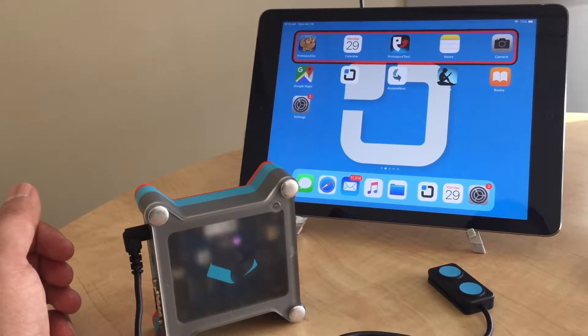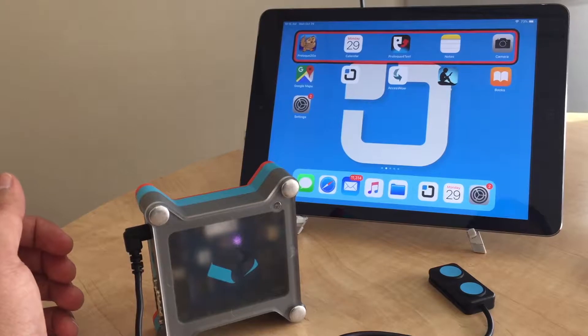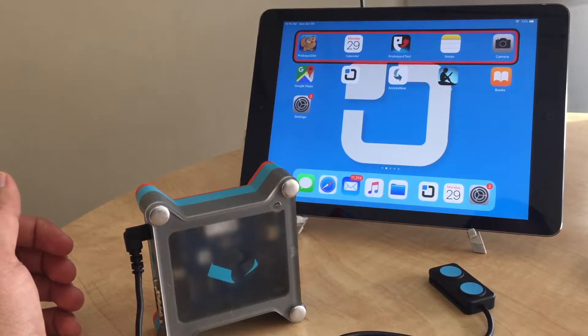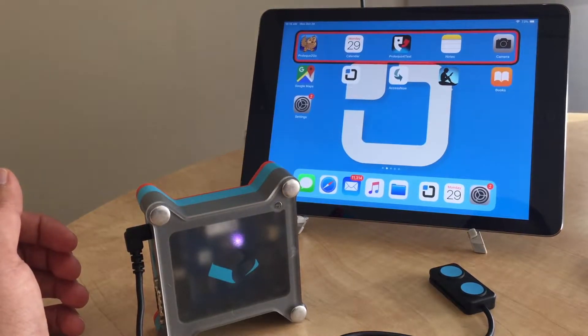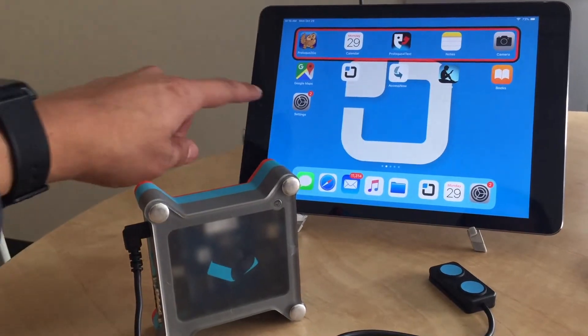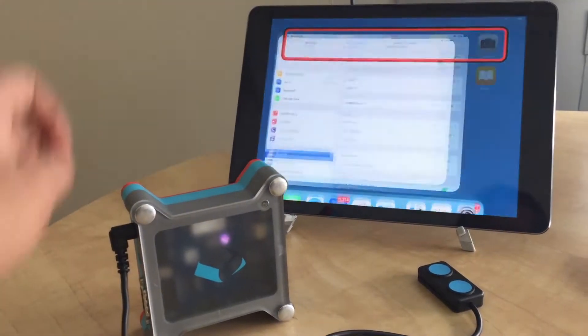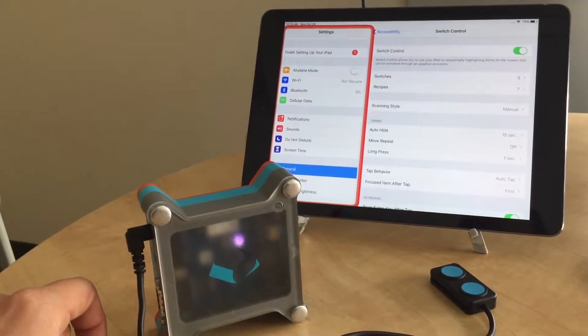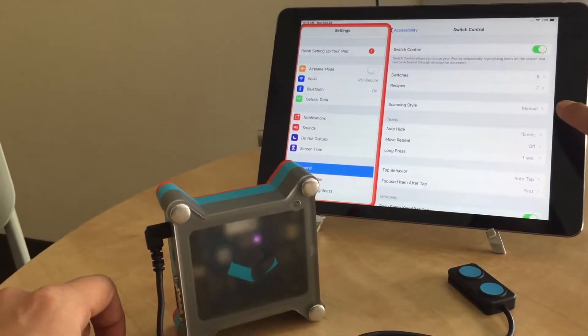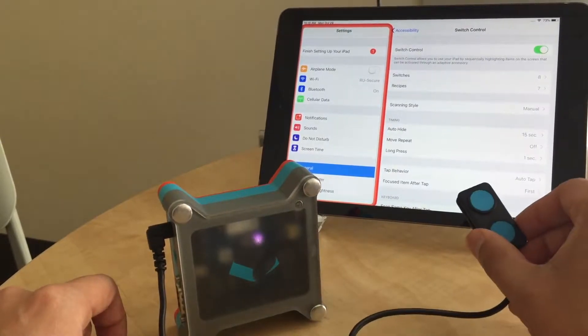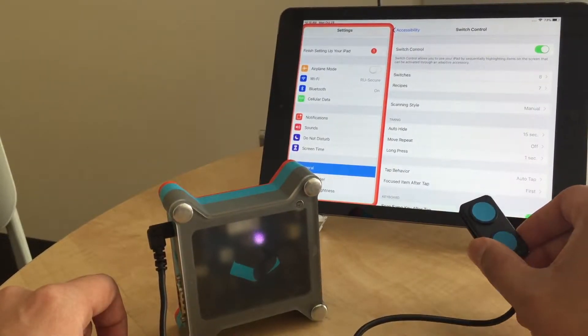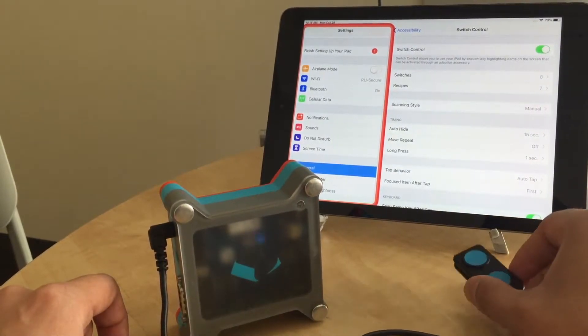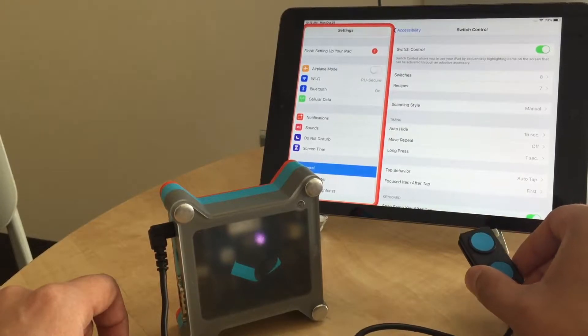If you're using Switch Control with the Tecla Shield and are having issues with the long press, there might be an issue with the settings. In this iPad I have step scanning with a dual switch, so top is select, bottom is next, and long press on the top is home.